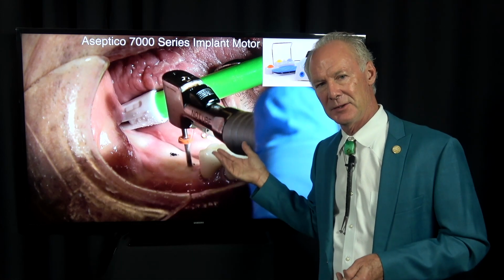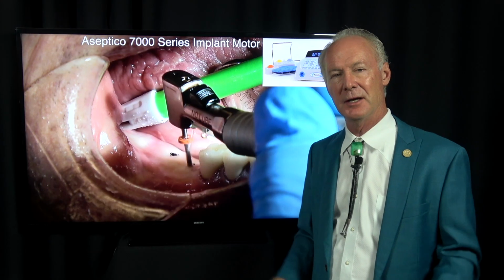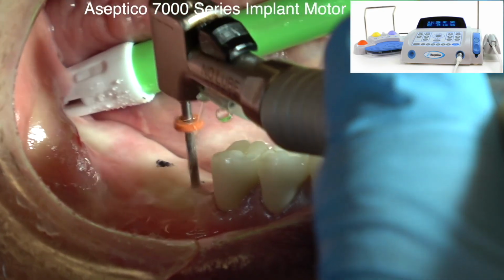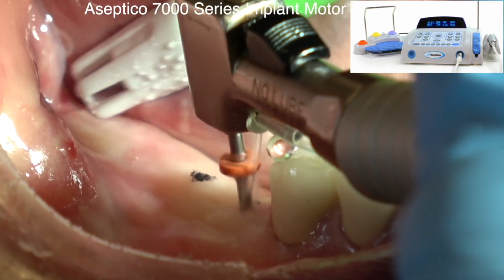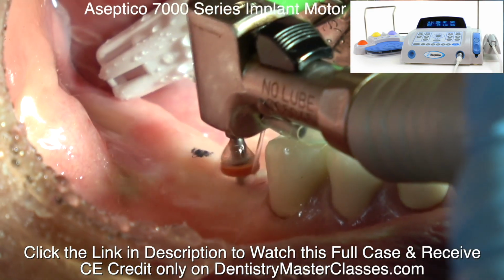Now why am I teaching this system? Number one, I like it, and many of you are not in the United States, or you're in a rural area or someplace that doesn't have a cone beam. So how can you place implants predictably without a cone beam radiograph? Like this. You don't need a cone beam if you use this system.